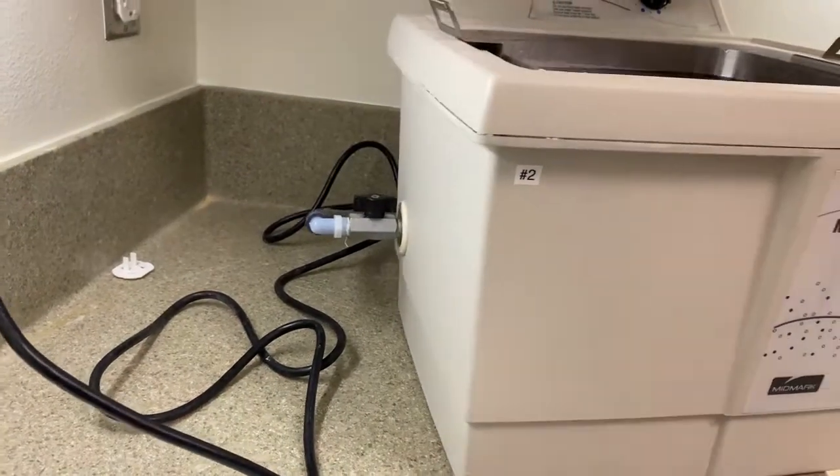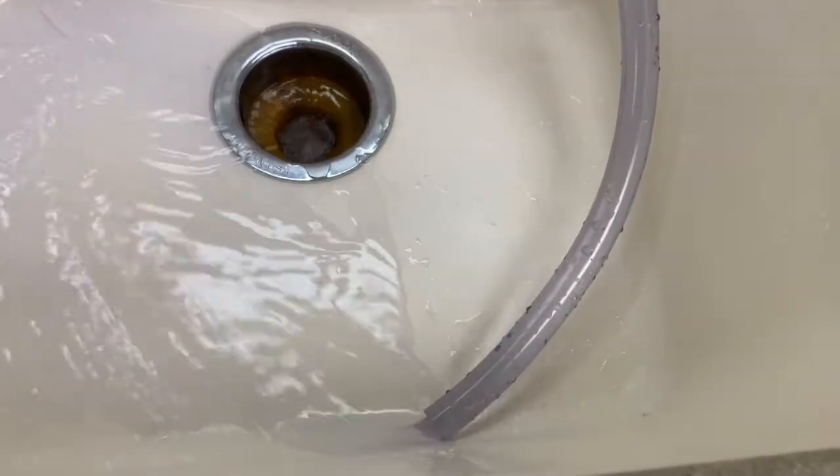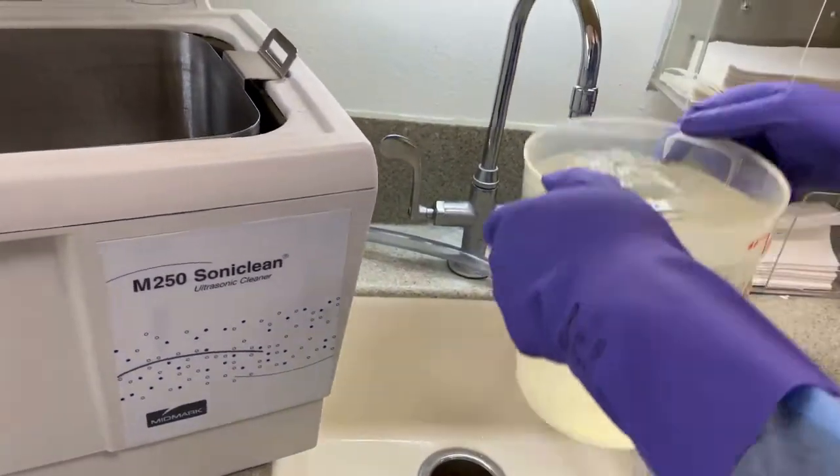At the end of the day, the ultrasonic has to be cleaned. In order to start the cleaning process, turn on the valve located on the left side of the unit to completely drain the system.